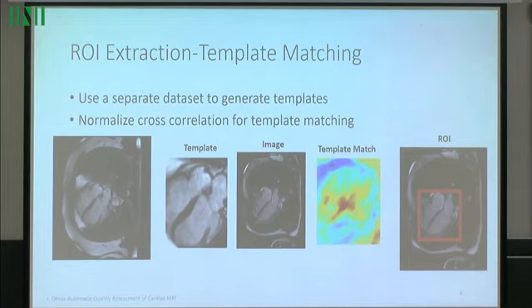We use a normalized cross-correlation based template matching algorithm. We average 100 MR images which are independent from the LVOT detection algorithm validation dataset in order to generate our template. The extracted region consists of segmentation of left and right atria. Currently, we use manual segmentations on the separate dataset to determine these templates, but this step could be easily replaced with an automatic segmentation algorithm.